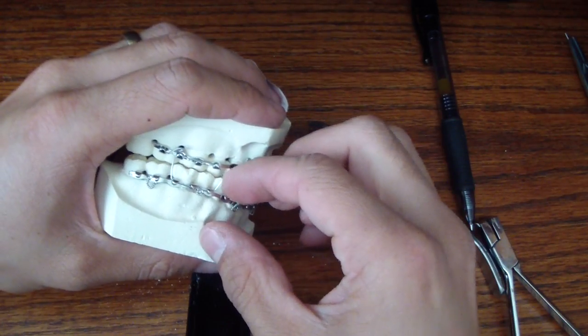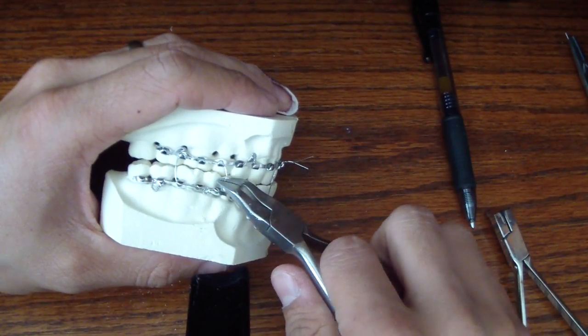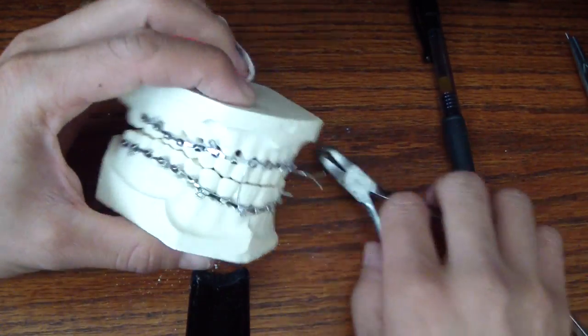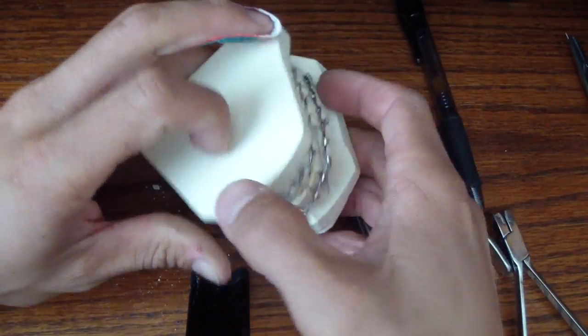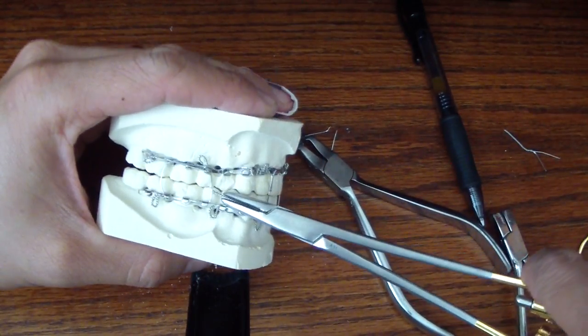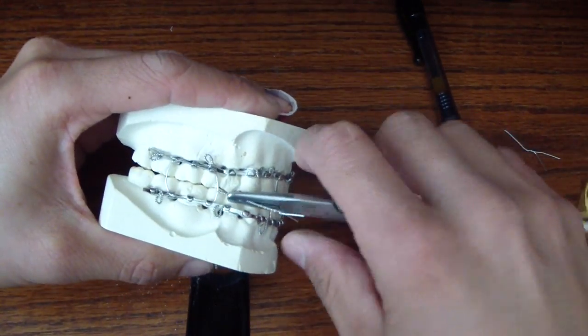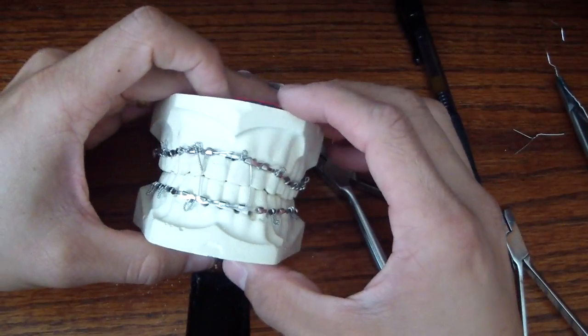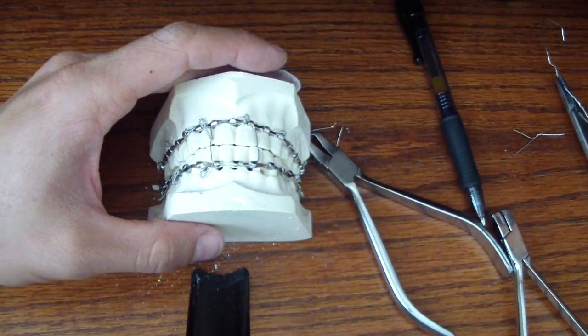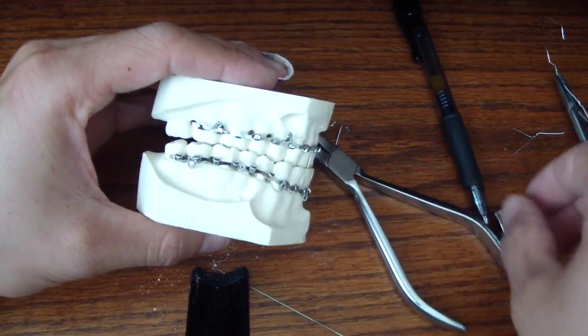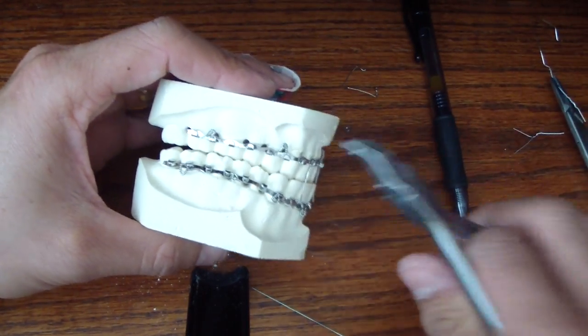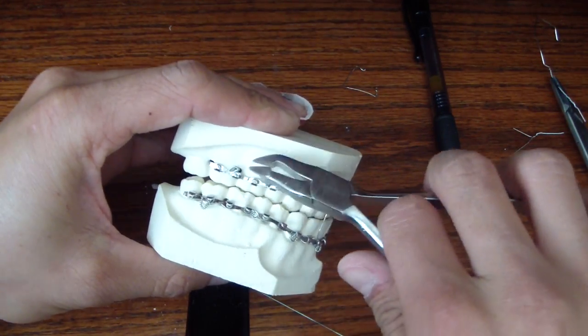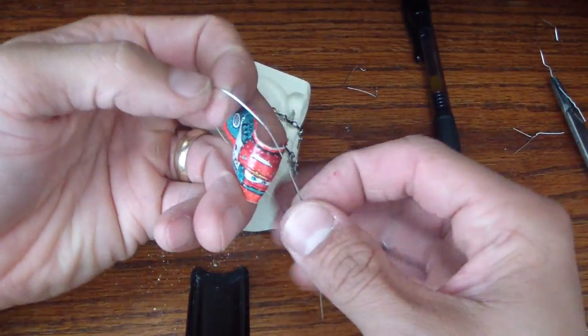I fractured that one, probably will redo that one. That'll break definitely. So that one will get redone. This tells you that it is critical - this is a great learning point - that you do have to do each tooth. Look, after I tighten that down, it's already loose. For demonstration purposes only, we're just going to continue. This is making that fish loop.